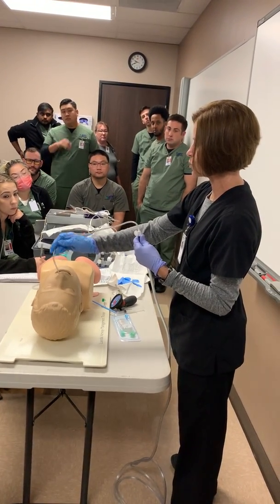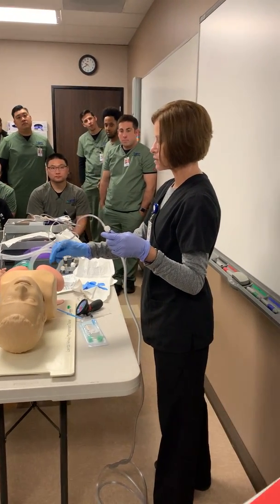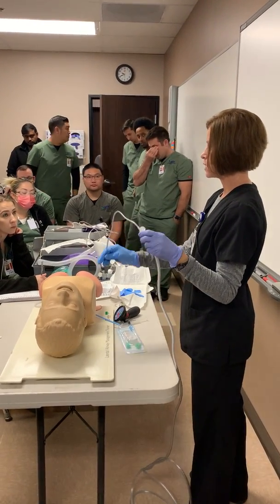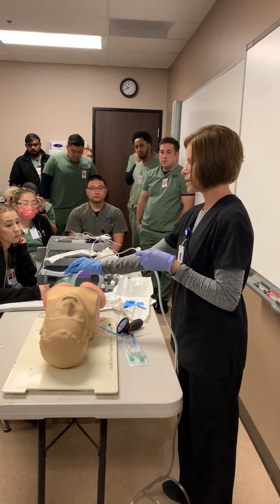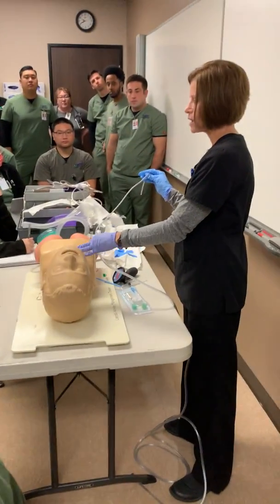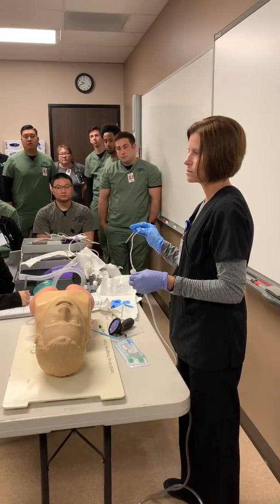So how do you know how far to put the catheter in? A lot of times you'll go down until you get to a little bit of resistance after you've heard that change in breath sounds through here, because what that means is you've gotten past the glottis and you're actually down into the patient's lungs. I'm not going all the way down into the lungs, I'm kind of going probably more to the carina. And there's some patients, when they have a lot of secretions, they can cough it up to kind of the back of their throat, but they can't actually clear them. So that's where we would do this. Does that make sense?